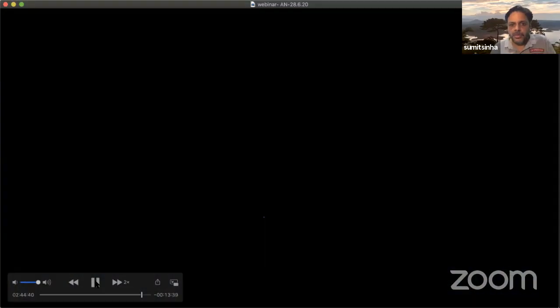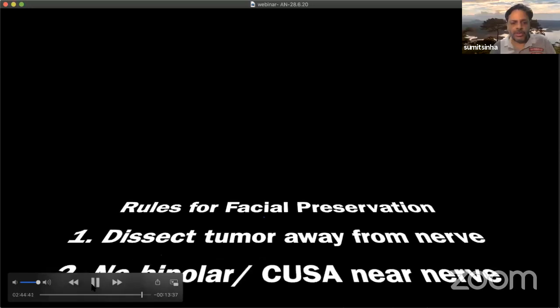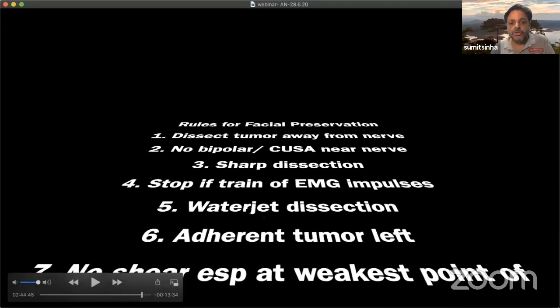Okay. So this is the rule for facial preservation, which I wanted to project to convey to the residents. Always dissect the tumor away from the nerve. I always stressed in the discussion, there should be no bipolar or CUSA used near the nerve, never. There should always be a sharp dissection over this facial nerve. Stop the dissection if the train of EMG impulses comes. Use water jet dissection off and on at times, and leave the adherent tumor.